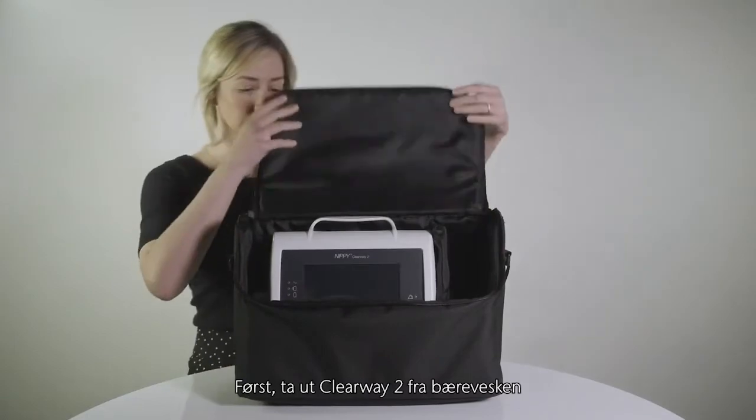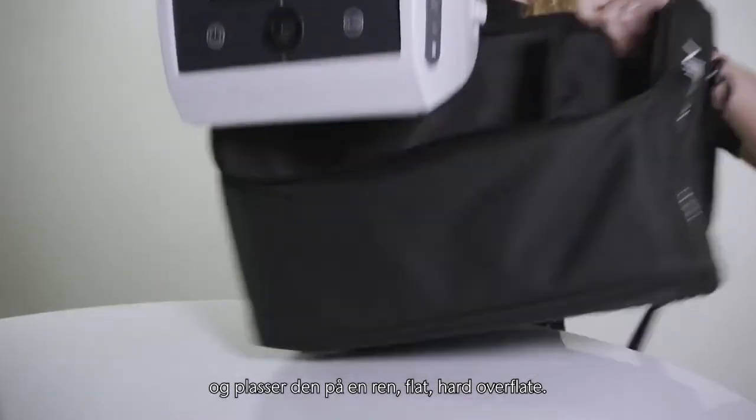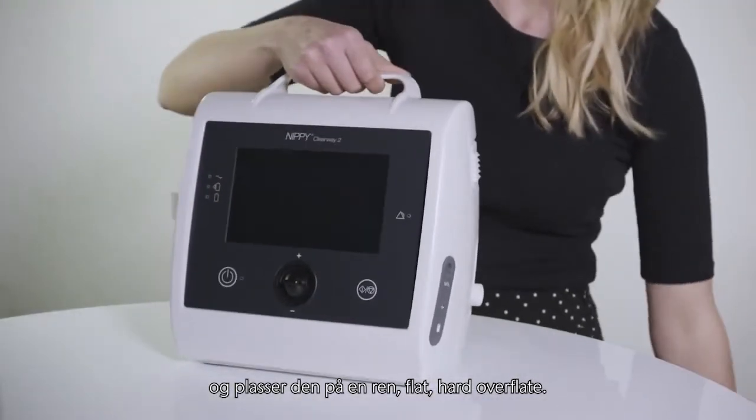Firstly, remove your Clearway 2 from its carry bag and place it on a clean, flat, hard surface.